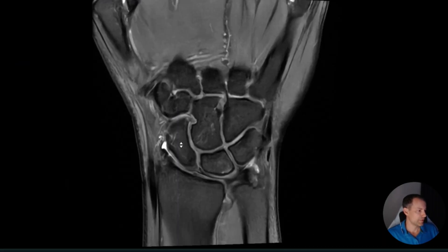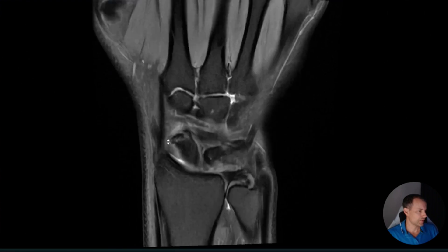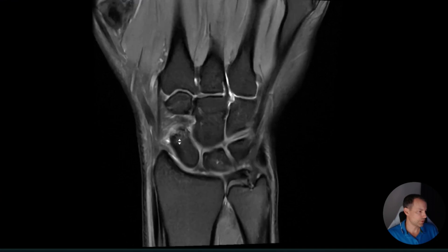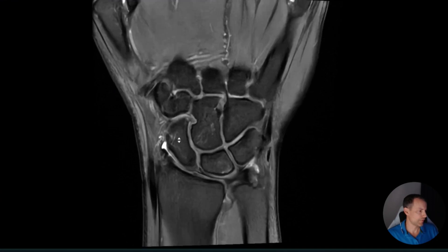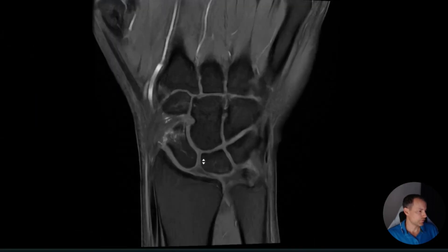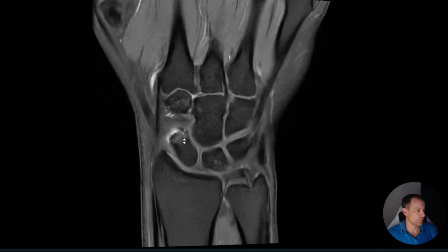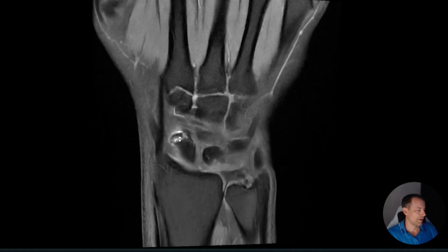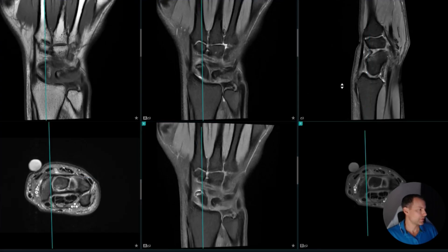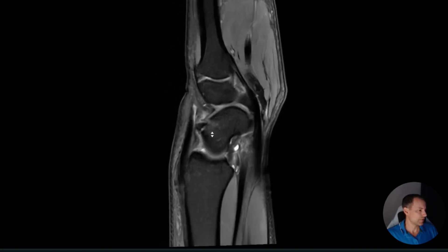On the coronal we see this ridge where we see some edema around it in the joint capsule, bone marrow edema, and a bony ridge on the dorsal aspect of the scaphoid. Now when you look at the post-contrast study we can see there is intense enhancement exactly at this ridge here in the midsection of the dorsal scaphoid. The same we can see on the sagittal here.